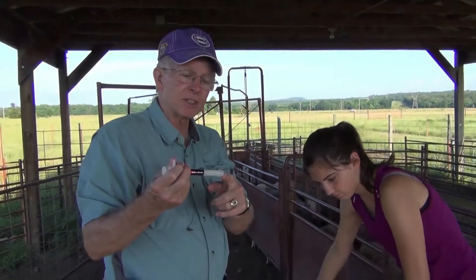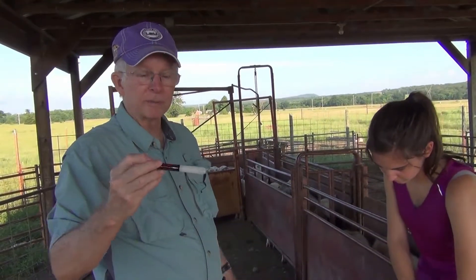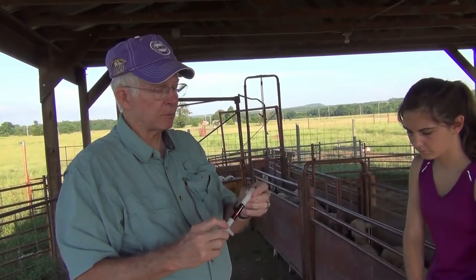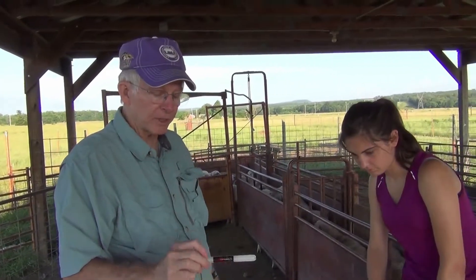With a standard pill gun, it should be gone. These are very reliable, but because the animal is chewing, this is plastic, so you may not get very many pillings out of each tip. You need a lot of these because they'll really chew up the plastic area. When you're ready for another one, just pull it off, put another one on, and away you go — very simple.